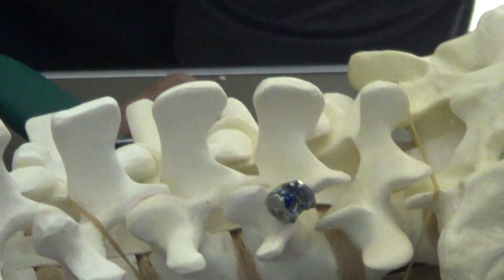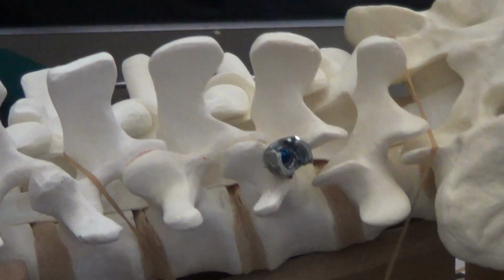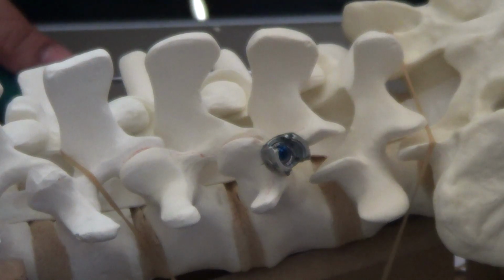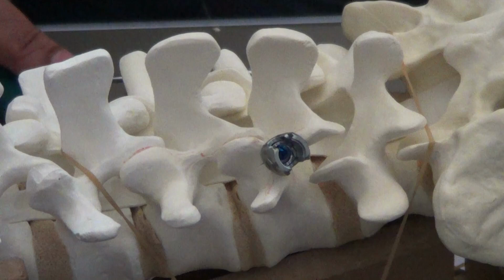Okay. So what I would suggest, each one of you pass the screw, and like I said, it helps you go straight. Okay. Gabriel, will you do the S1, please?